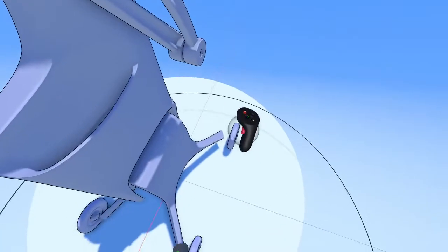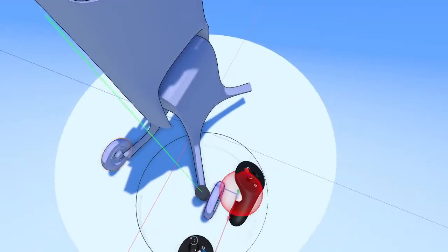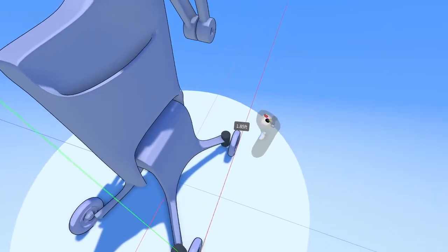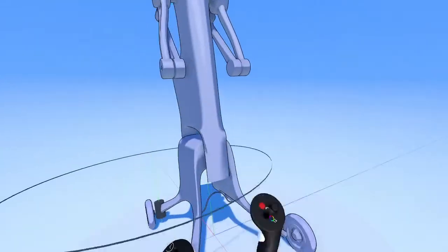Again, no need to remake things, so let's just unlock all our layers here, delete that wheel, duplicate this over like that. Looks good.